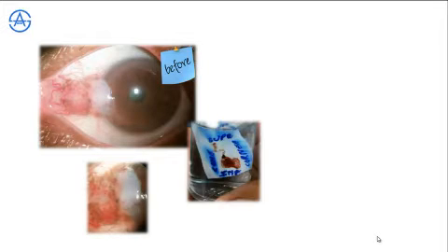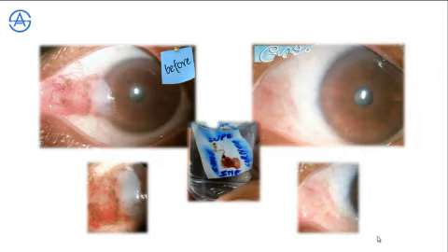Now, this was how the specimen was excised and marked on histo paper so that the pathologist would know the corneal surface, the conjunctival surface, as well as the superior and inferior. It is kept in absolute alcohol after excision. Post excision, in 2 weeks, this is how the eye appeared. The corneal surface had taken up well.